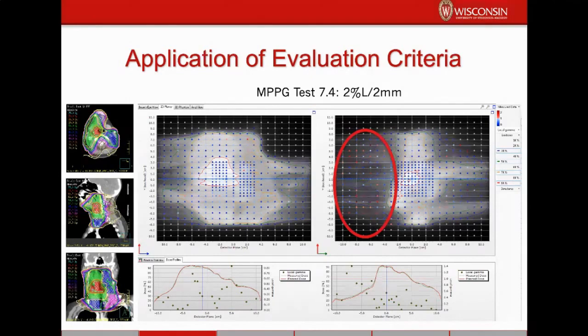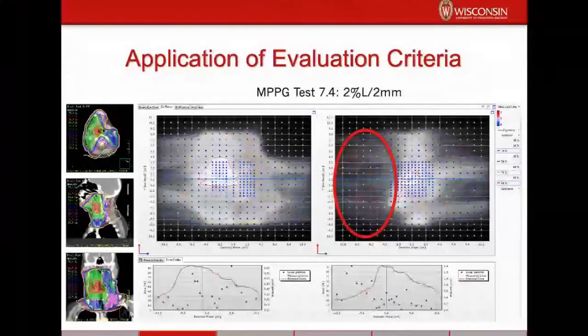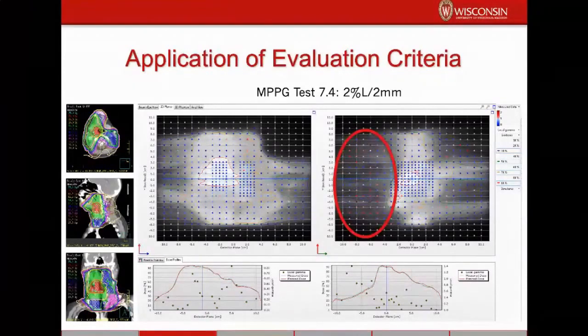Definitely, yes. So there are some things that patient-specific QA doesn't give you. So most of the time for patient-specific QA, the way that you model the patient-specific QA device is, unless you're doing like film and ion chamber in a real phantom, if you're doing something with a diode array or an ion chamber array, very often you're not using a CT scan of the thing that you're doing a dose calculation on.